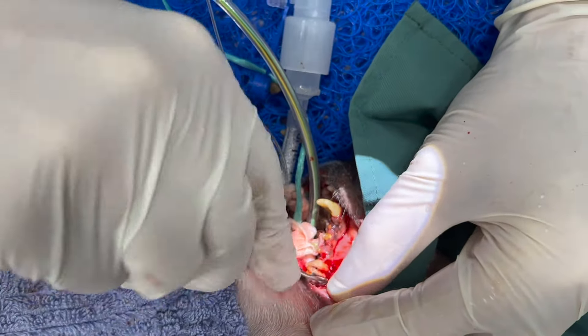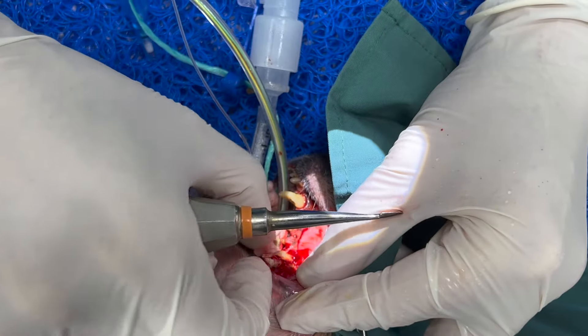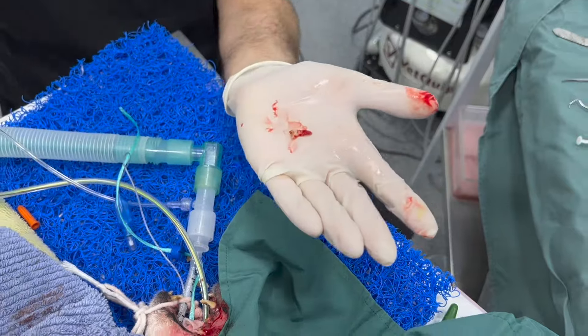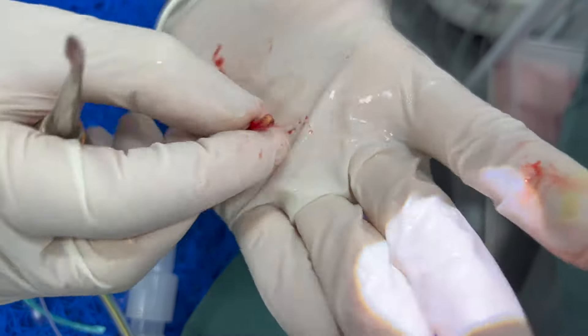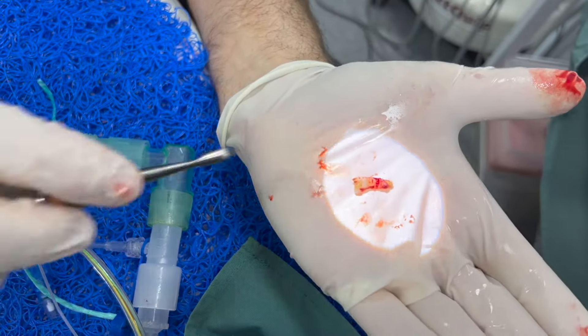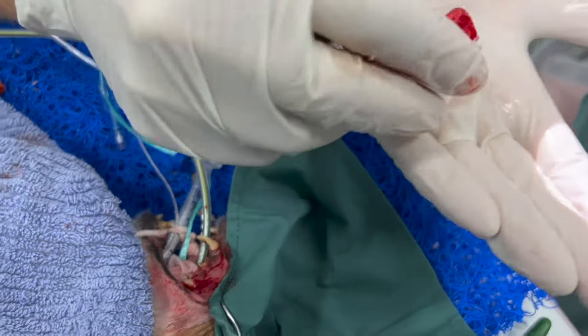Trying to elevate the tooth out — and you can see it came out beautifully. You can see the tooth root there. It's pretty damaged with some abnormalities on the root, but at least one root has come out absolutely beautifully. Now we're going to work on the next two roots of this three-rooted tooth.